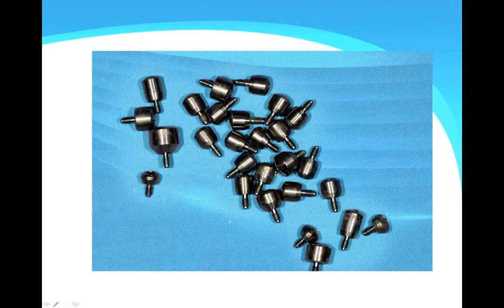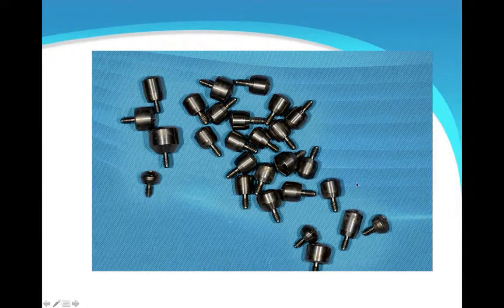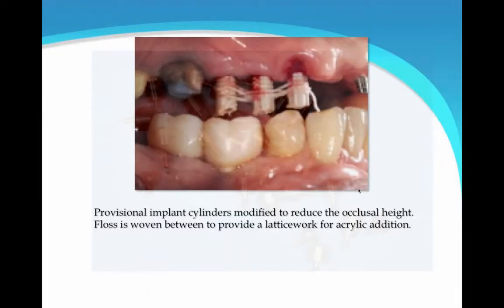So what we ended up with, I had bags and bags of healing caps, and you can see in just one kind of implant, there's any number of sizes and lengths. There's just no doubt it's confusing. And after a while, we would be sent a bite, and then I could start screwing in healing caps to try to figure out which one it was, and rarely did it work.